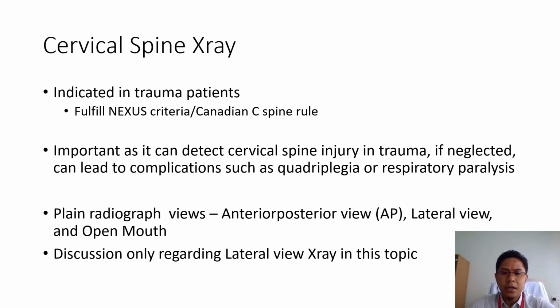As you can see in my slide, the indications for cervical spine X-ray in trauma are guided by the NEXUS criteria and the Canadian C-spine rule, but the simpler one is the NEXUS criteria. In trauma, the cervical imaging doesn't have to be a more complicated CT scan.